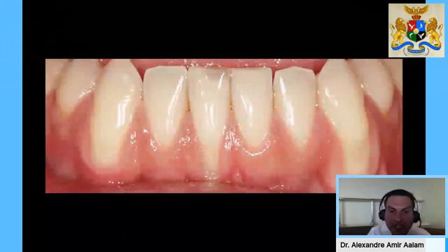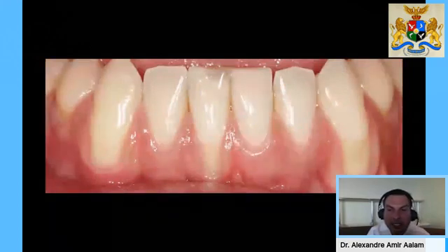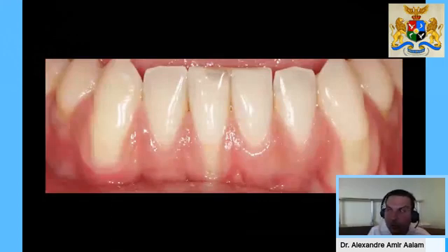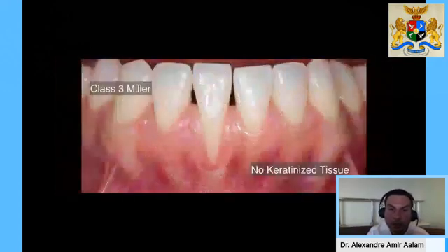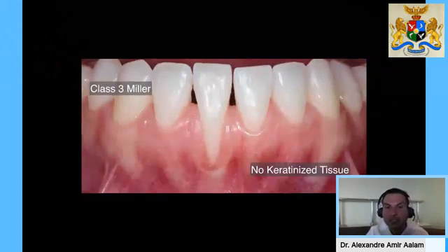Again, another challenging mandibular case. Canines that are exposed, very avascular surfaces, very difficult to graft because of the location, with the mentalis muscle basically pulling and creating a physical obstacle in terms of, again, the concept of biotensegrity. But following the same concept, we're able to deepen the amount of vestibule, gain root coverage, increase the amount of keratinized tissue, and hopefully improve the longevity of these dentitions for this patient and allow them to enjoy their teeth for the longest time, away from sensitivity, from discomfort, and of course, improving their aesthetic appearance.